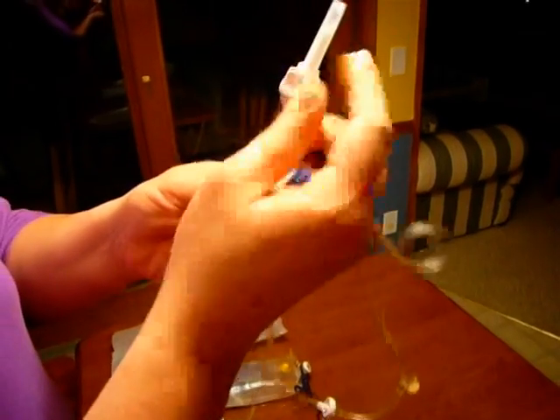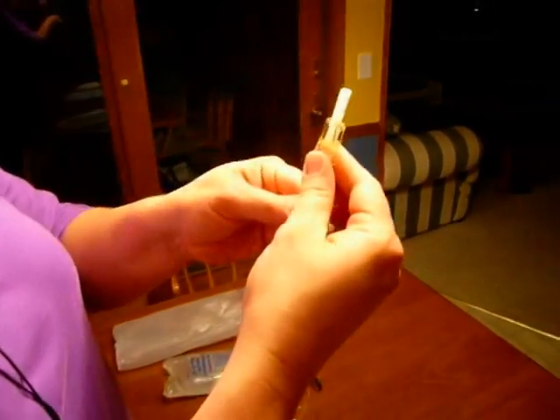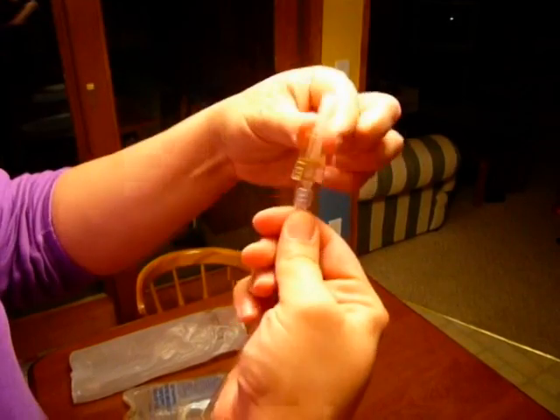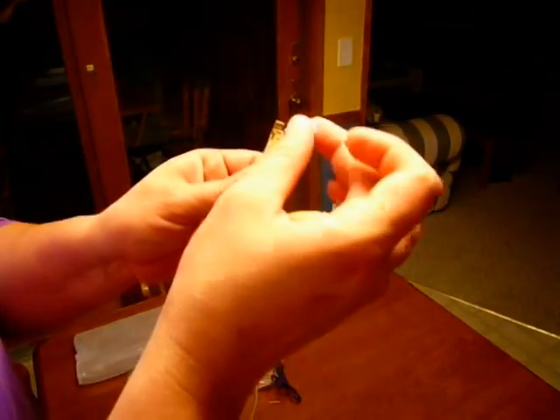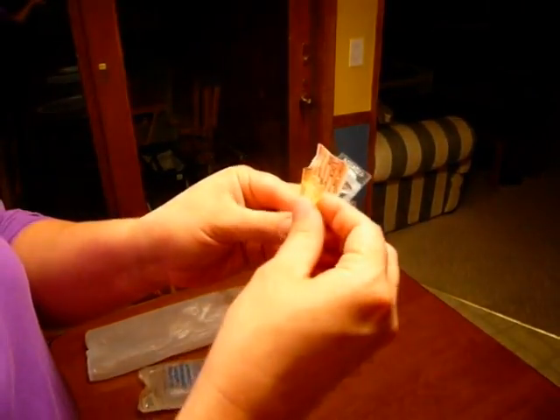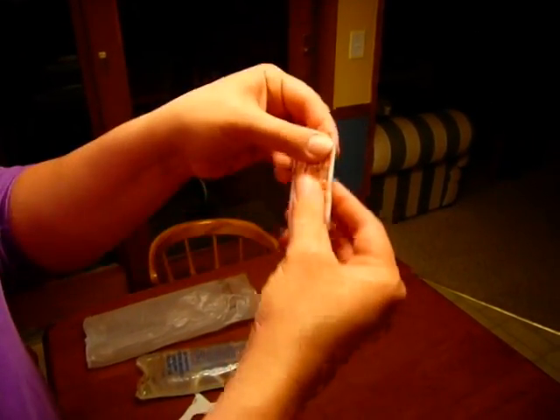Now that this is done, I'm going to put my sterile spike cover on nice and tight. My roller clamp is down, and I'm going to come down here and reset this by taking off the orange clip by loosening it and pulling it down, taking this off, and then I'm going to recover it with the blue cap that you had in your container first, and I'm going to put this orange clip back in its package the way that you had it, which is like this, and covered like that.